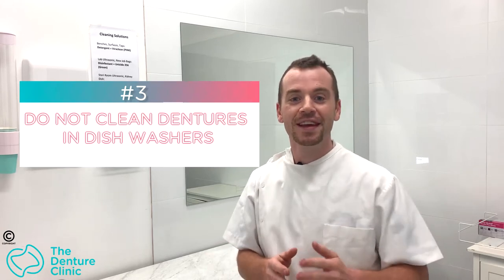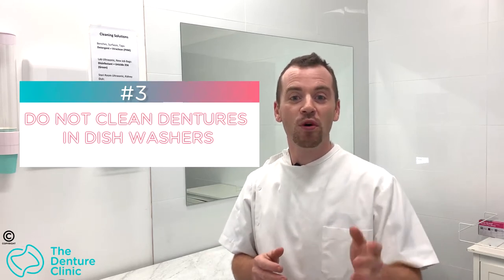We don't want to use bleach and we don't want to use hot water. Just cold or mildly warm water and soap to clean is all that we need — that's more than enough. Tip number three: dishwashers. Dishwashers are made to wash dishes, not dentures. The huge heat inside the chamber of a dishwasher, the hot water — these things are not meant to be around dentures. It's too much and it's going to warp your denture.